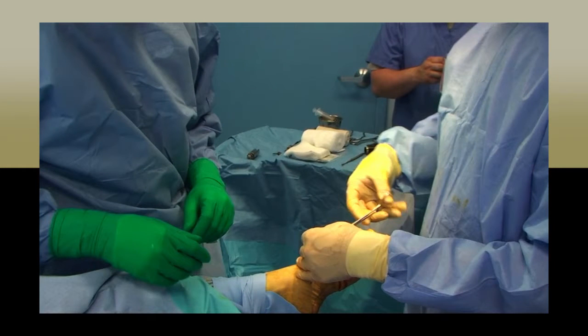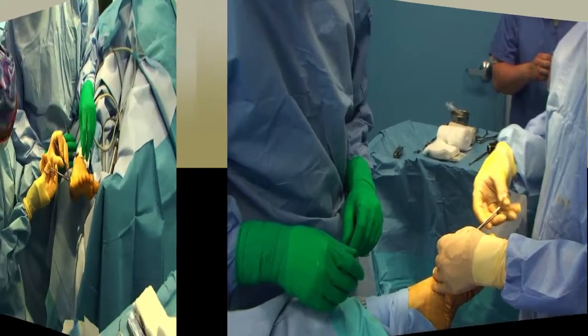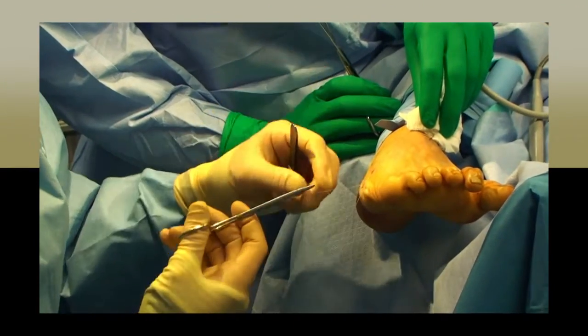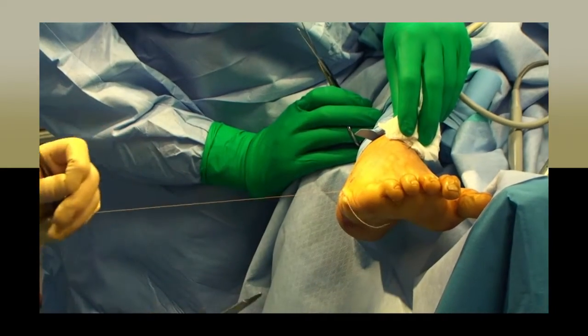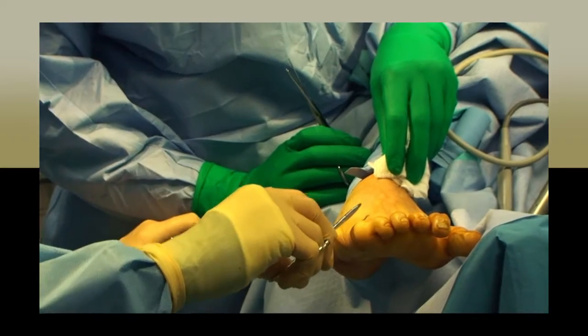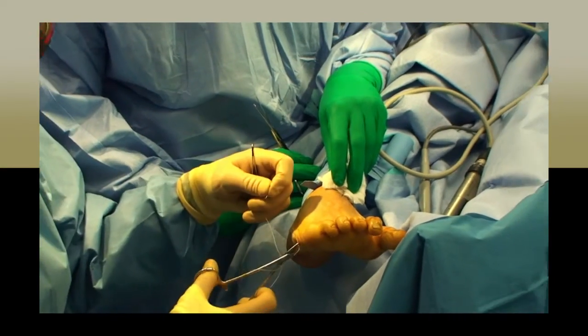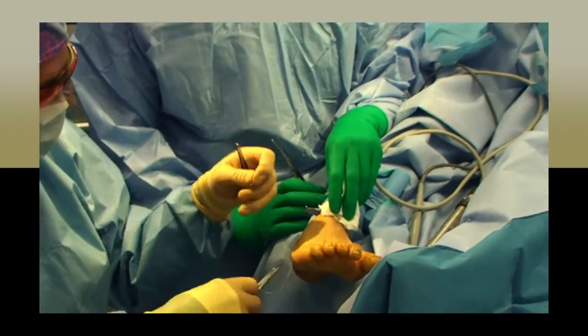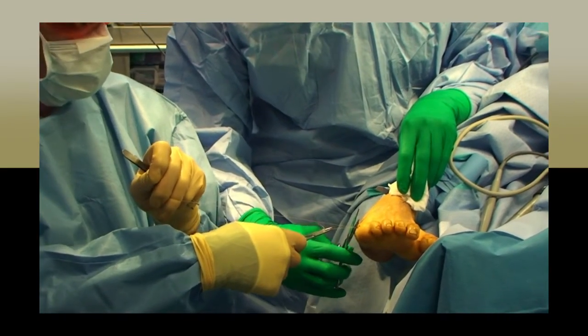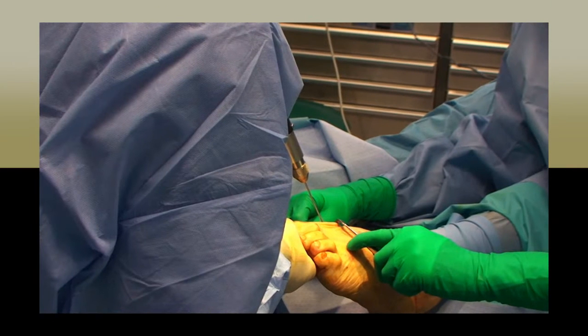As you assist the physician more and more, you will begin to learn the procedures and know how to anticipate what the physician will need and when. Your duties as a scrub will be to pass instruments, set instruments down in an organized fashion, and be in charge of the sterile field. It is your workstation. The physician is merely visiting. You will need to be ready with gauze and sponges to help clear the area for visualization, as well as serve to retract the surgical site so they can see where he's operating.